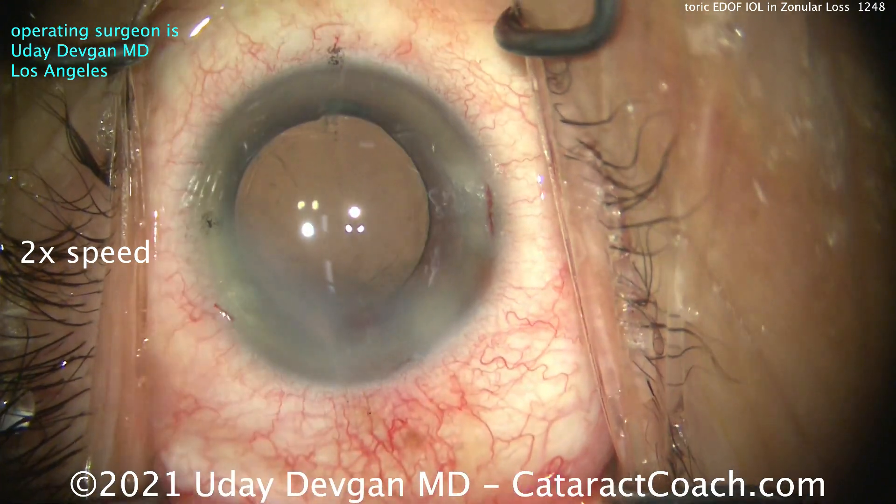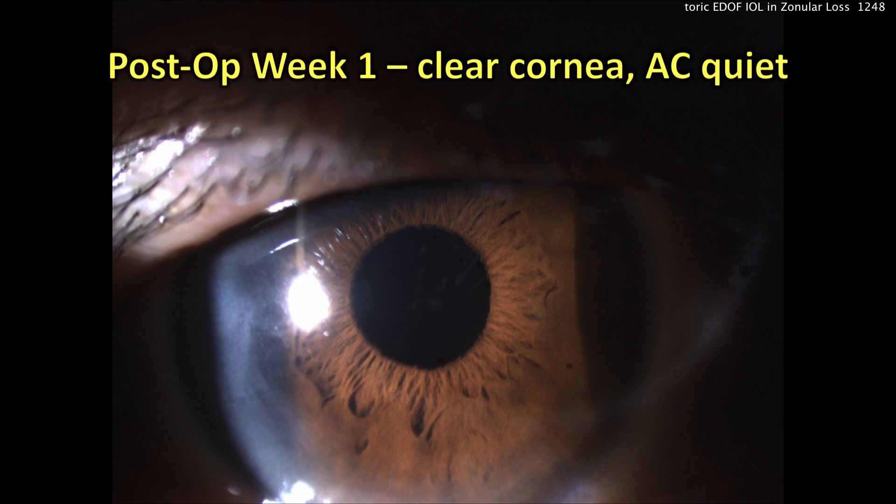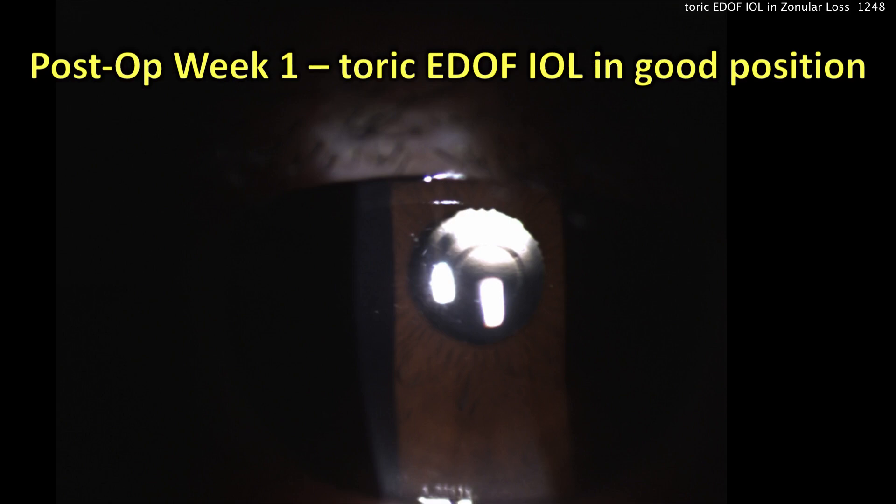Let me show you the post-op pics — I'm pretty happy with the result. Post-op day one, as expected, some mild corneal edema. A nicely centered lens — I like that. The incisions are sealed up, the lens is at its correct orientation. The AC is quiet, cornea is clear, and the patient is seeing great. I'm so happy, I'm so relieved. Here's that central focusing element — the EDOF central element is beautifully lined up in the central visual axis. The bad news is the patient has a second eye next week, and I'm going to show you that video tomorrow.